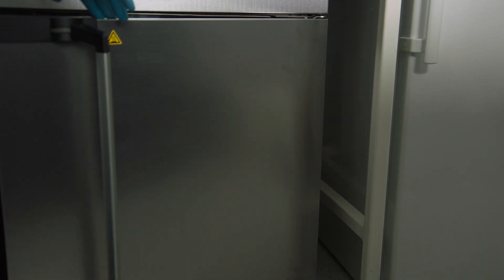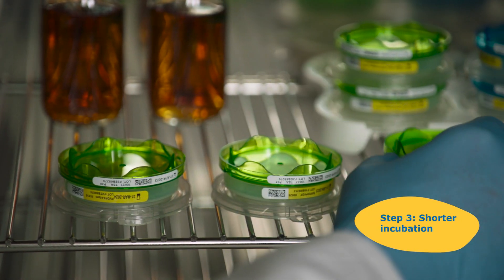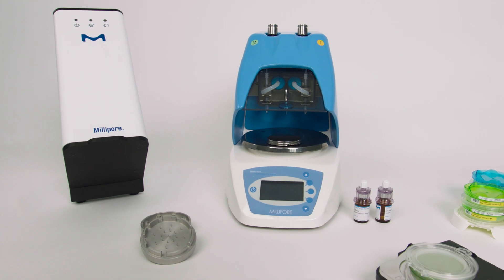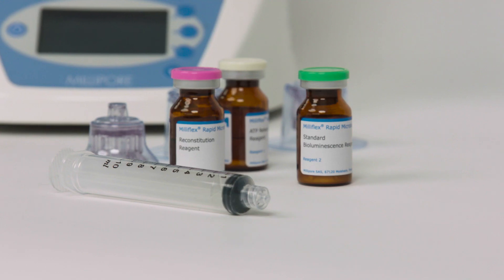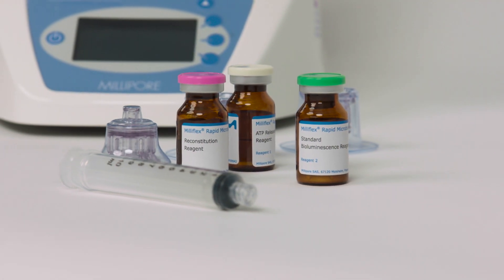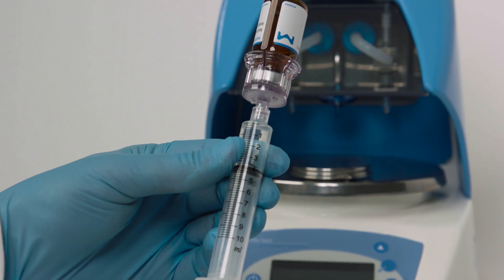Incubation takes only a quarter as long as for traditional detection methods such as membrane filtration and pour plates, thanks to the sensitivity of ATP bioluminescence technology. Colonies are detected at an earlier growth stage to deliver much faster results.